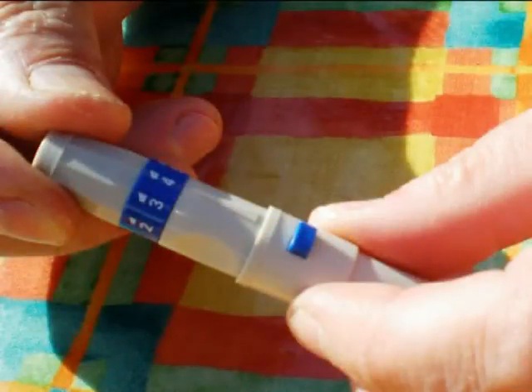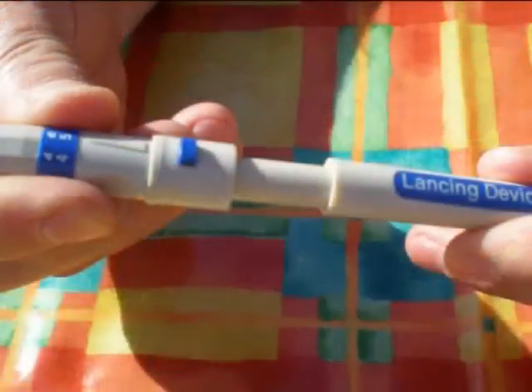There are 5 settings. We have experienced that depth 5 gives the best results, however you should feel free to experiment and see what works best for you. Once you've chosen the depth, you can set the lancing device by pulling the bottom part and holding onto the top part until you hear a click, and then releasing.